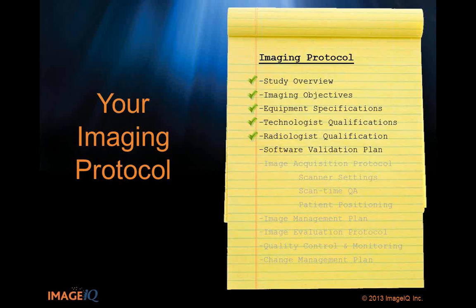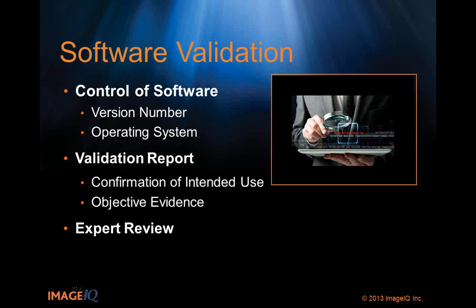Amit? So when you think about software, you might say, well, my radiologist is making the measurements, I don't really need to validate software, there's no software. But they're using software to make the measurements. I mean, I haven't seen a radiologist pull out film and a ruler in several years. Right. And to that point, they're using calipers and measurement tools in their vendor's PACS system or whatever software they're using, and they're just drawing a line on an image. It's a caliper, but that has to be translated. There has to be a pixel spacing in the header somewhere on the image that gets sent to the caliper and tells it exactly what size it is. You need to make sure you've validated that you know what that measurement is.